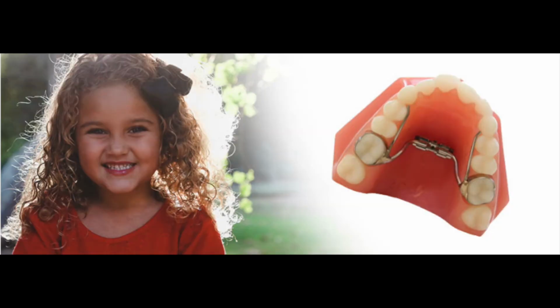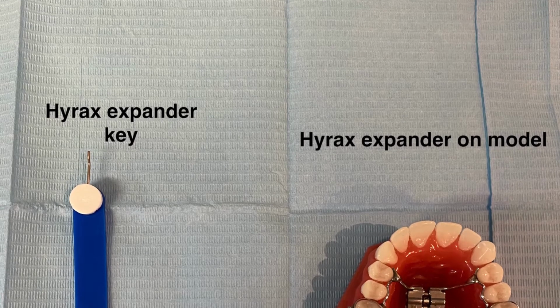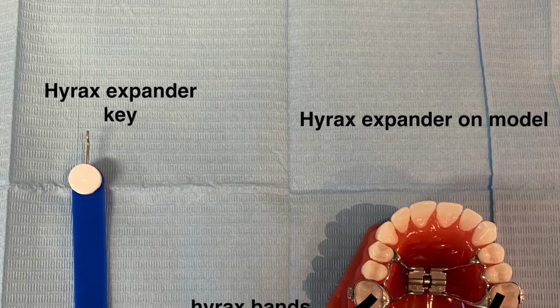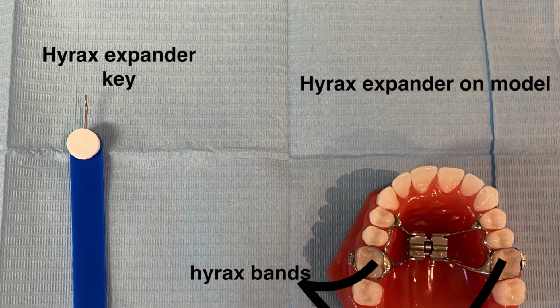Right after you get your expander fitted, it may feel tight and somewhat uncomfortable. Occasionally there is some tenderness and soreness of the teeth for a few days. Don't worry, this will pass and soon it will feel a lot better. Sometimes discomfort may also be encountered while the expander is being turned, usually as a very tight or pushing sensation. This is again normal and it will subside approximately 10 to 30 minutes after each activation.